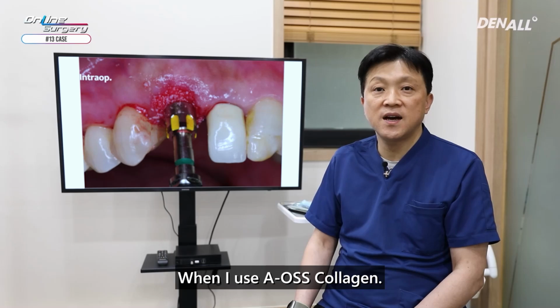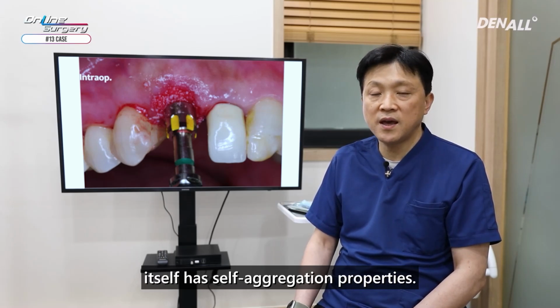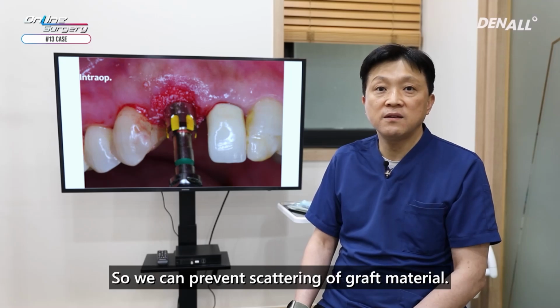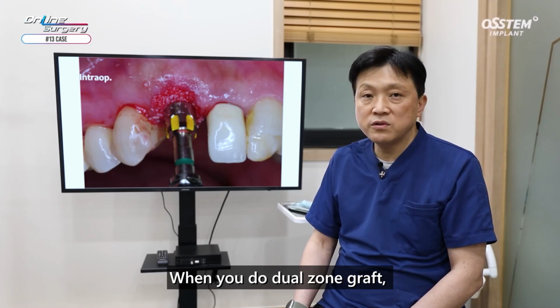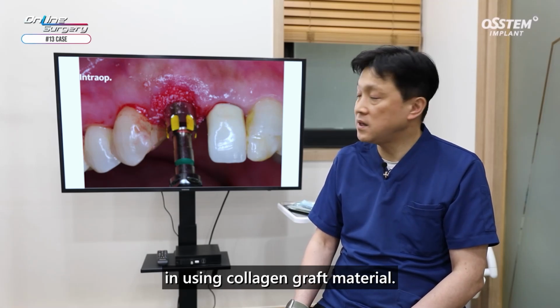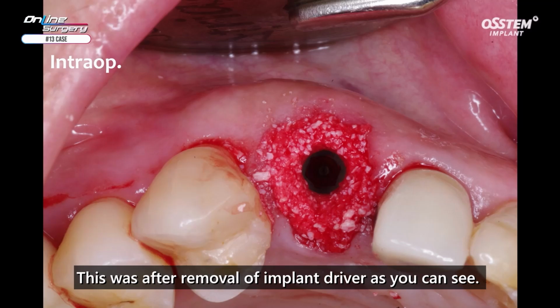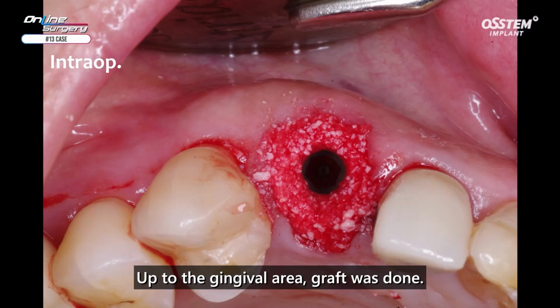When I use A-OssCollagen, the collagen graft material itself has self-aggregation properties, so we can prevent scattering of graft material. When you do dual zone graft, I think it has many advantages in using collagen graft material. This was after removal of implant driver, as you can see. Up to the gingival area, graft was done.